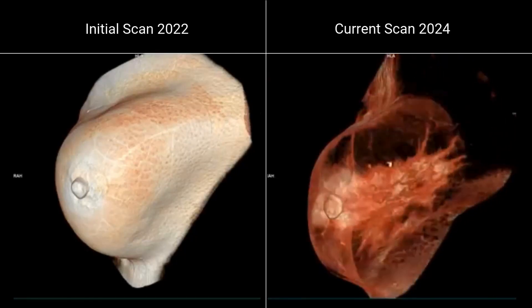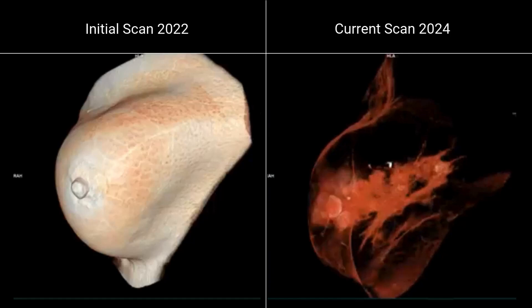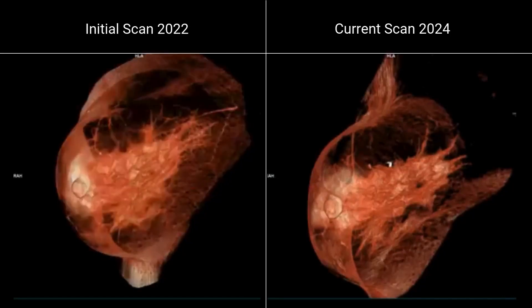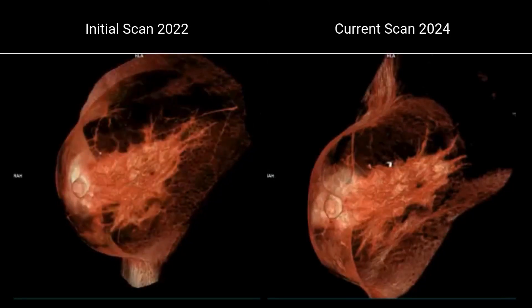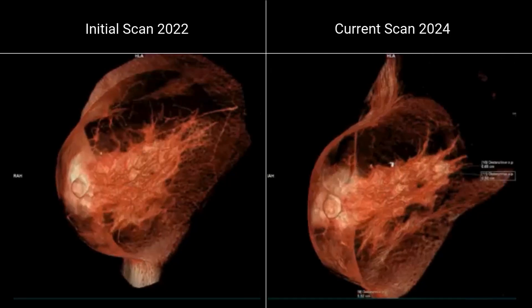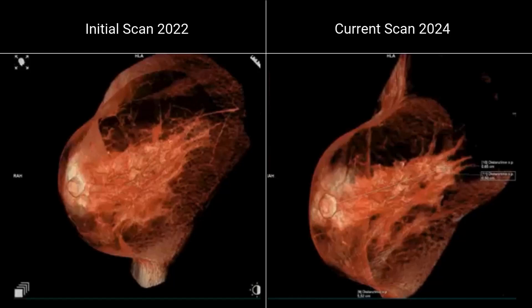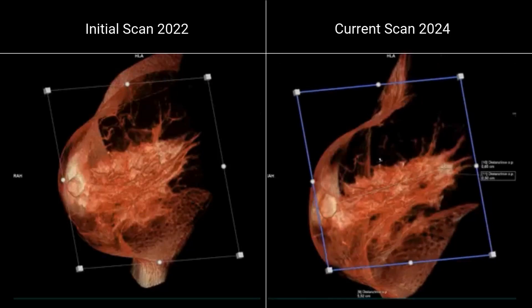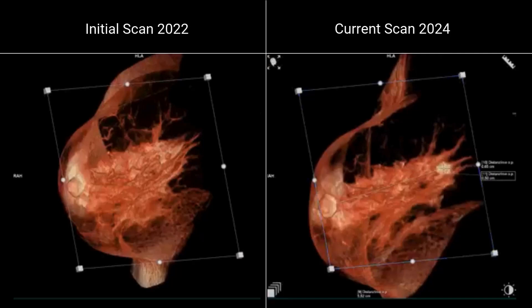Remember, we took only 12 seconds to do this scan with a high resolution of 0.15 millimeters isotropic voxel. This scan is done without contrast media, but you will realize very quickly that there has been a change in imaging between those images in the last two years. You see the old image on the left, the new one on the right side, and the difference is clear in a few seconds.